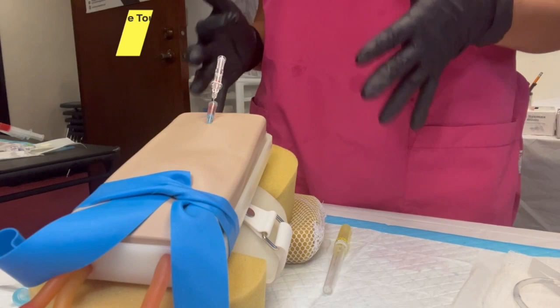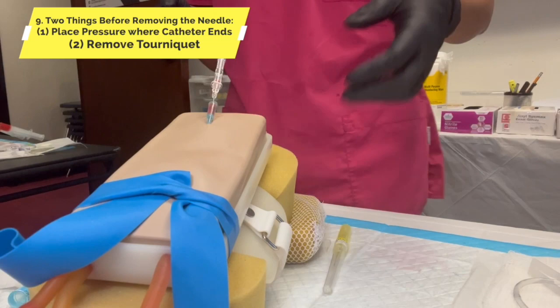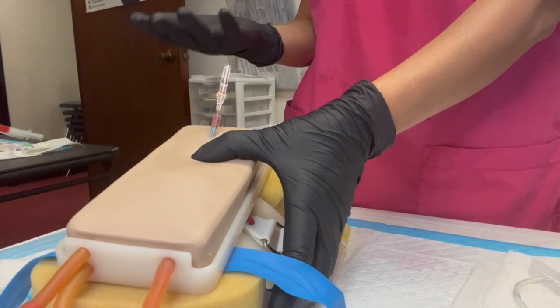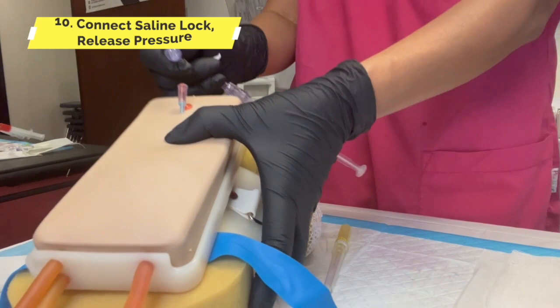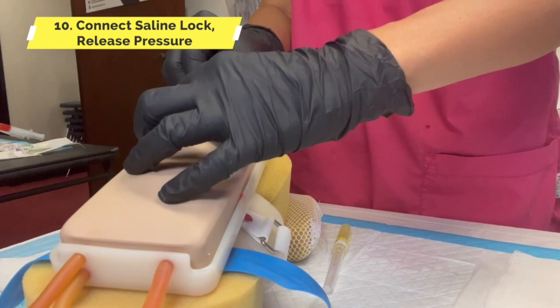Before we remove the needle, there are two things we need to do: apply pressure and release the tourniquet. So we did method A and method B. Now we're ready to remove the needle — that's the only time you remove it. Grab this — do we wait? No. Connect it right away — ta-da! After we connect it, let go of pressure. Hold the hub, and what do we turn? Only the clear.